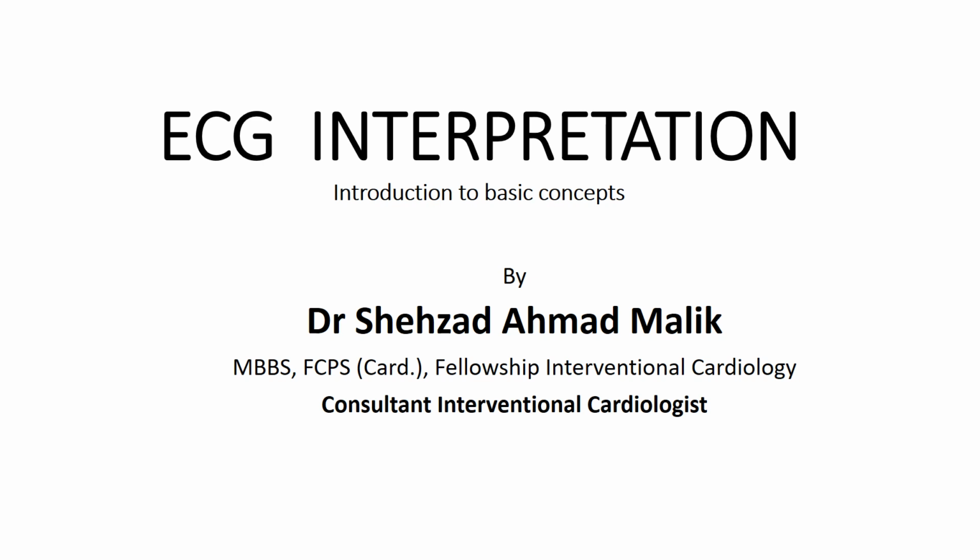This is Shahzad Ahmad presenting the first video in the series of ECG lectures, and this video is meant for introduction to basic concepts in the interpretation of ECG.